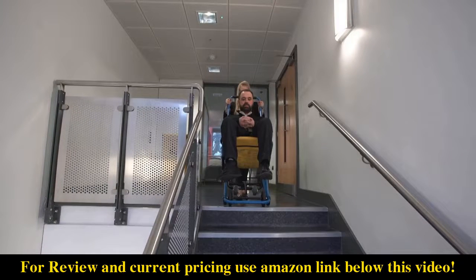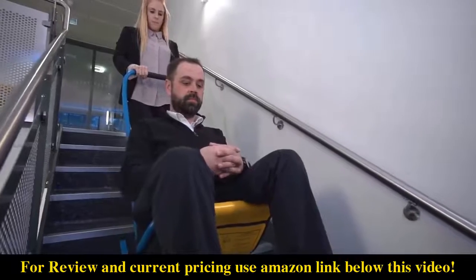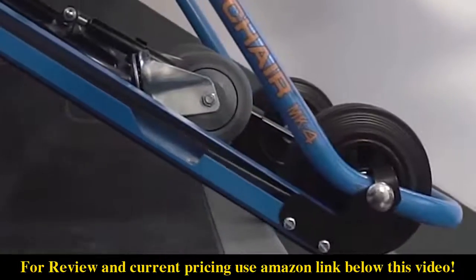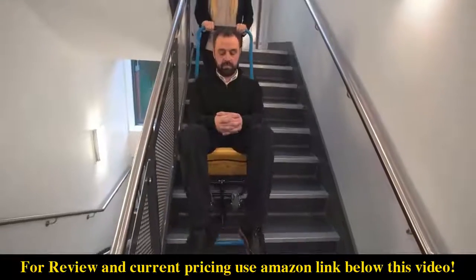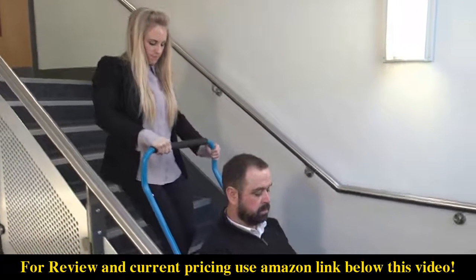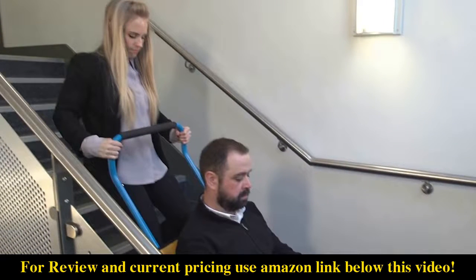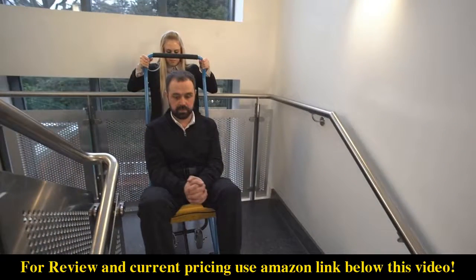Lean the chair backwards and with both hands at the side of the handle, push confidently over the top stair. Ensure the tracks make contact with the top two stairs. Position your hands on the top of the handle and push towards your feet to move the chair down the stairs, staying on the inside so you can easily turn on the landing. When reaching the end of the stairs, as the front wheel touches the floor level, move your hands to the side of the EvacChair handle. The EvacChair is easily maneuvered between stair landings using what is called the balance point.